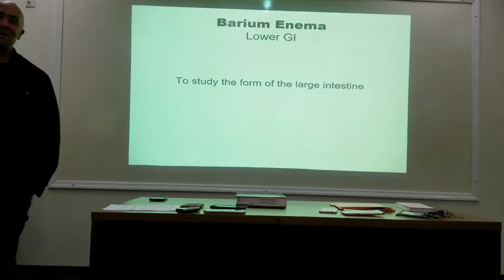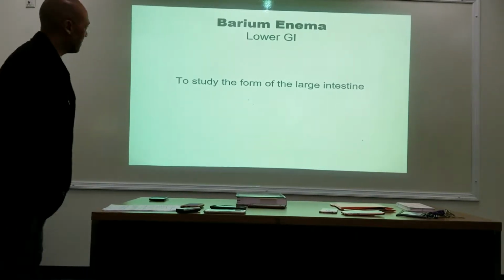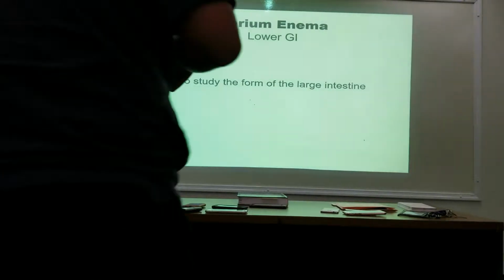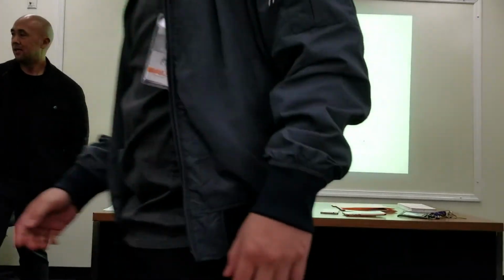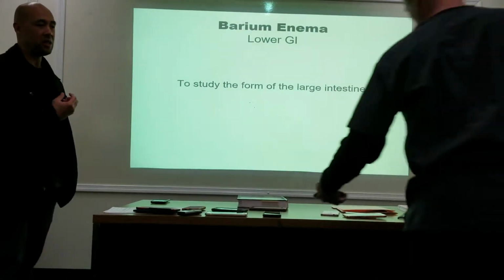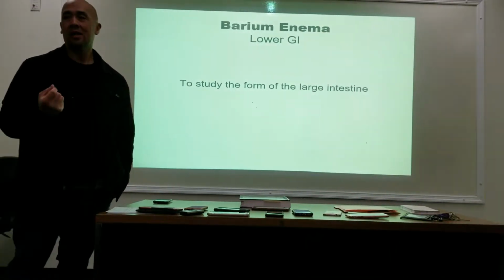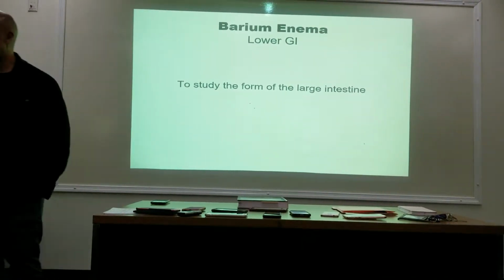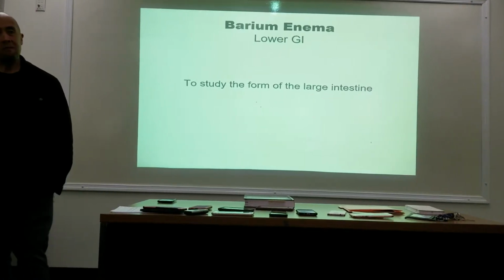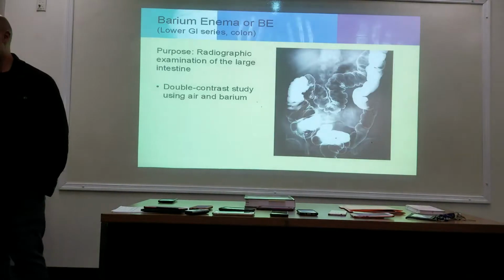All right, so the barium enema. Barium enema is a study of the large intestine. We also call it the lower GI. The most common way of studying the lower GI is with the use of barium, but again, there are contraindications, as with the upper GI and also small bowel, so we need to be careful in the use of barium.